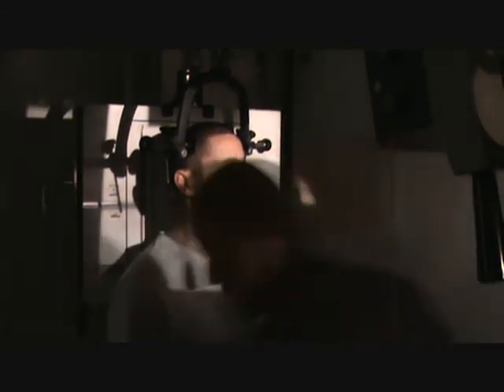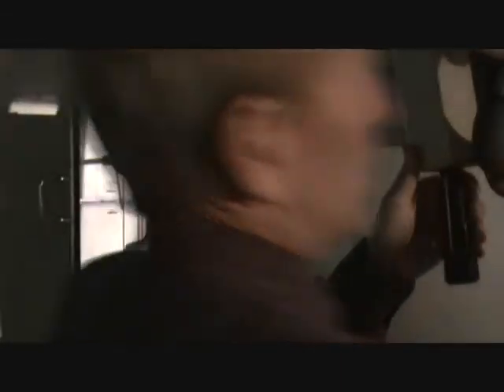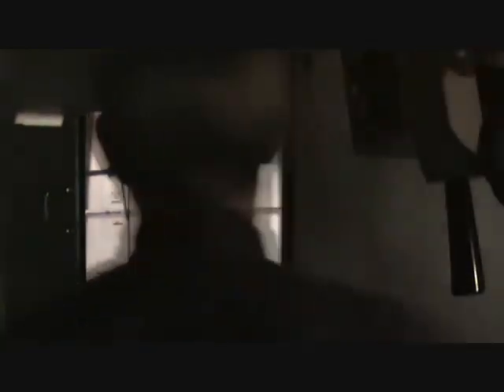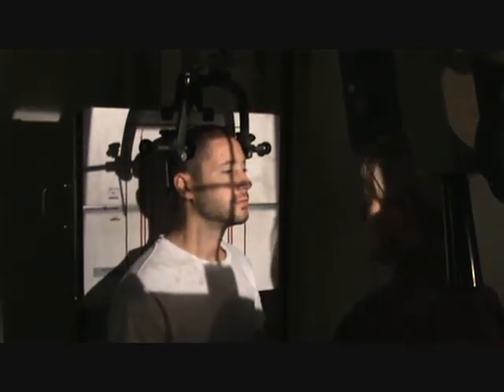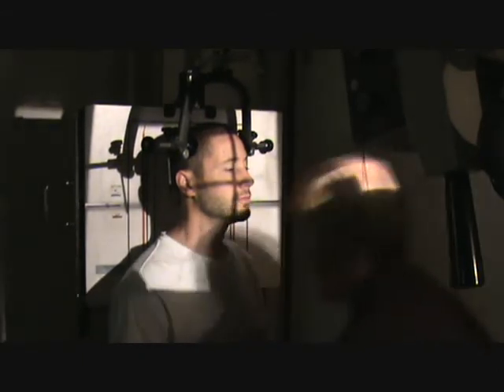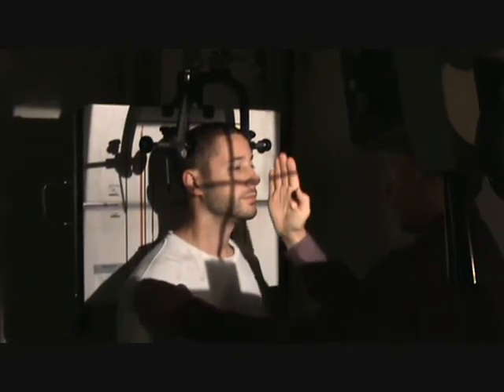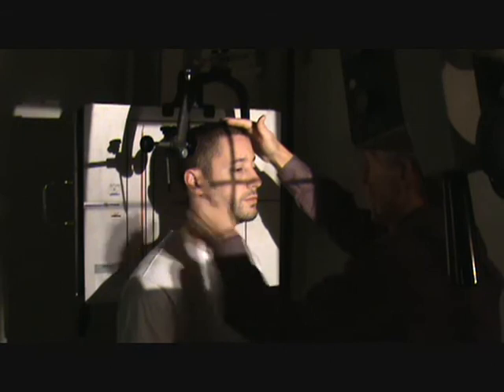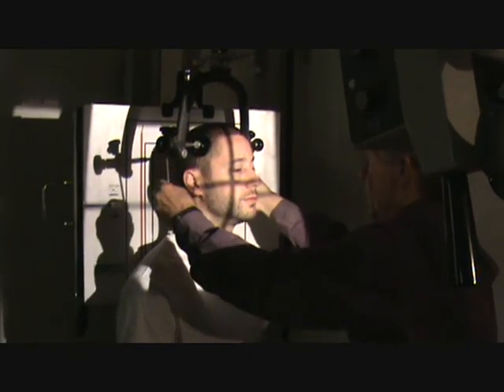Making sure this normal head carriage point lines up with the other one. The ear pointers are pointing right. I need to get my vertical collimator crosshair through the proper points — I'll line it up on center since I had shifted it off and put it in the center detent. Now I need to move my patient parallel to the bucky until the vertical crosshair goes through the point marked for that vertical crosshair. The patient is a statue and just goes parallel to the bucky as we move them. I'll take out a little bit of tilt so this is straight up and down, then make sure my vertical collimator crosshair goes through that point, and bring that chin down just a little bit. Clamp them in, and get my ear pointers out of the way. Now I'm ready to collimate.